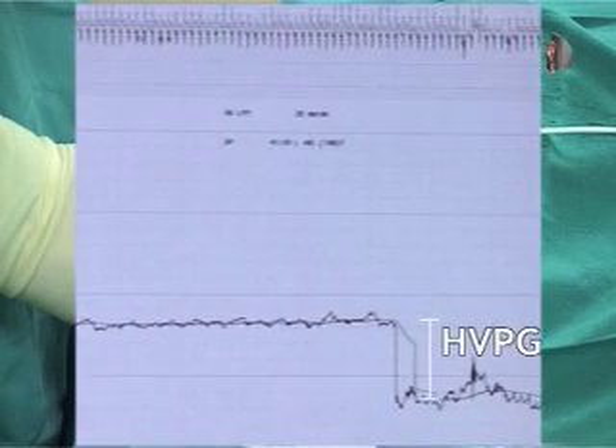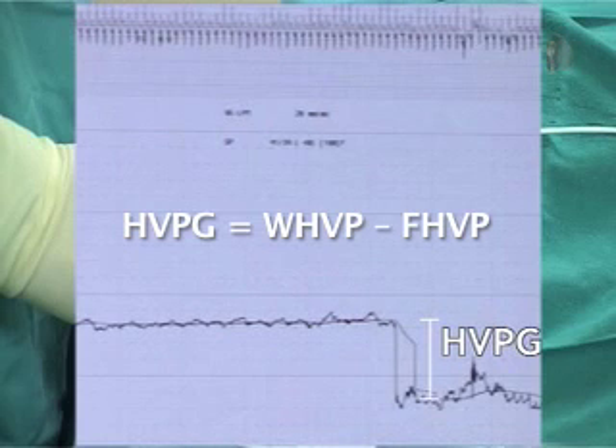The HVPG is calculated by subtracting the free pressure from the wedge pressure. Measurements are performed in triplicate.